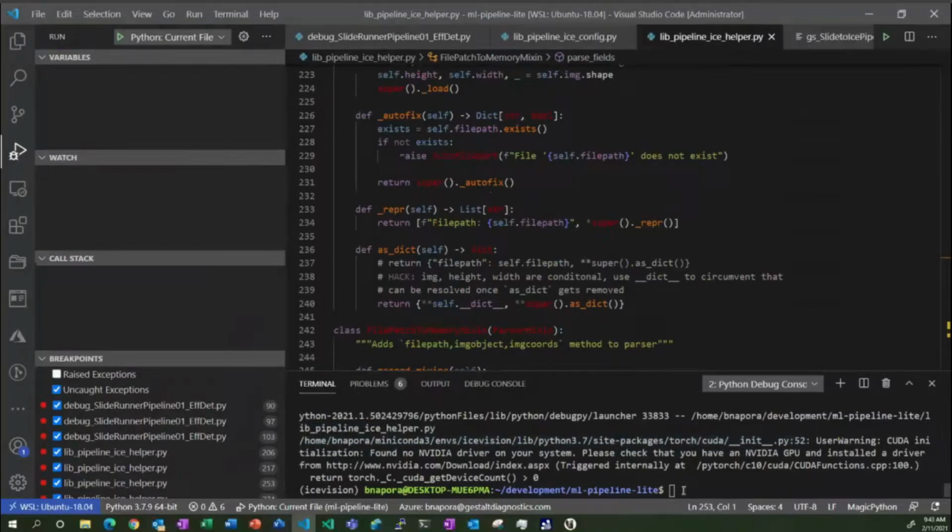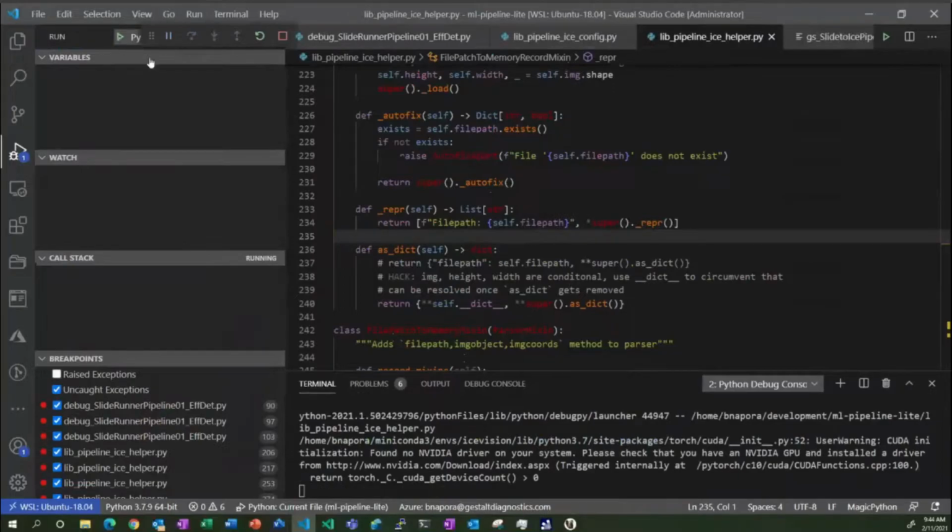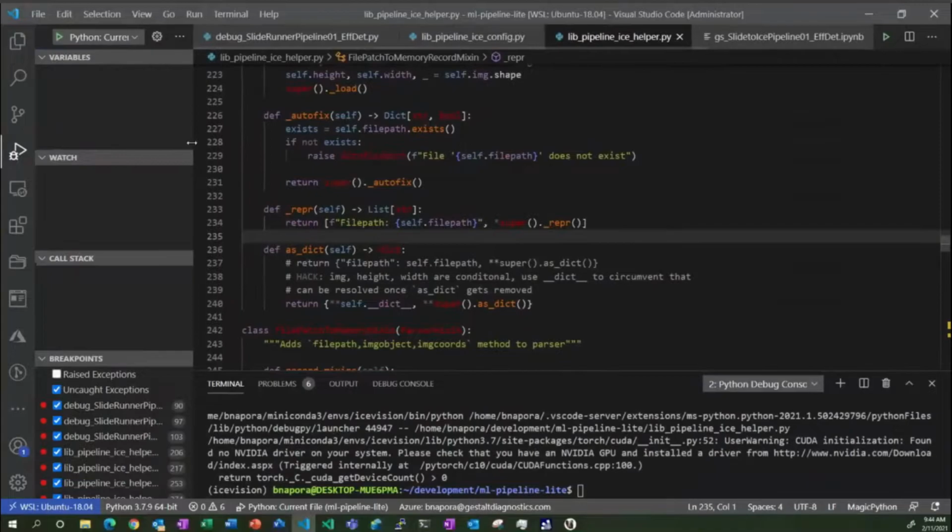And of course, I'm coming up against a memory error, which occurs not too infrequently on this particular laptop. I may have to just step through the code manually.